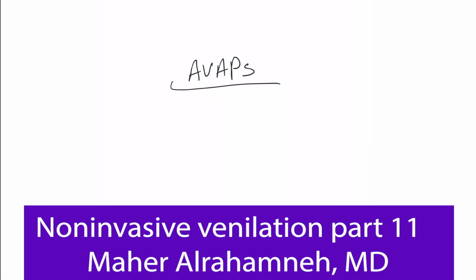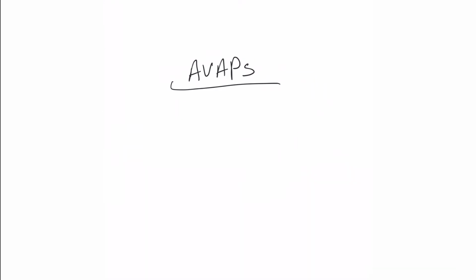Welcome back. Let's continue in our non-invasive ventilation mini course, and today we're going to talk about something called average volume assured pressure support. From its name, which seems a bit complicated but is easy to understand, just remember in BiPAP we have these two values, IPAP and EPAP, right? And based on the delta P or pressure support of this, we achieve our ventilation up and down, tidal volume, as we explained.